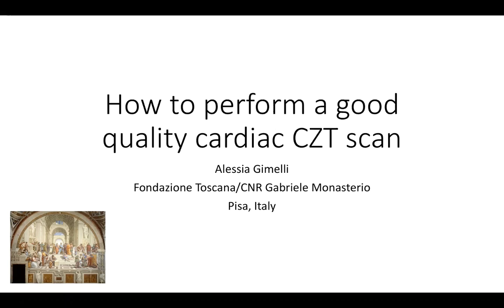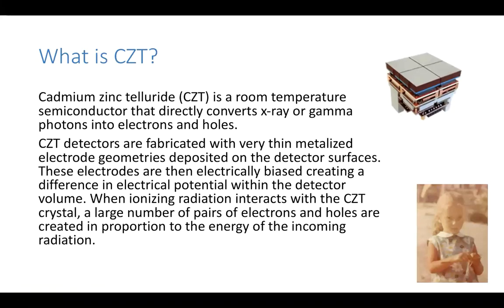Due to the fact that these cameras have completely different characteristics, we will try to explain why and when you need to pay attention in order to obtain the best quality scan at the end of your acquisition. But first of all, what is CZT?